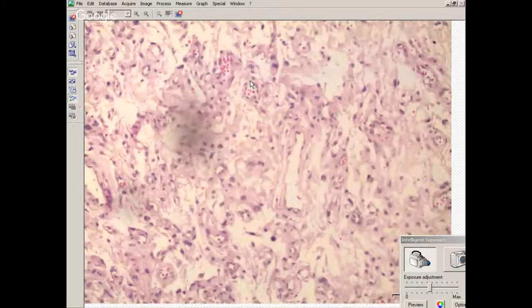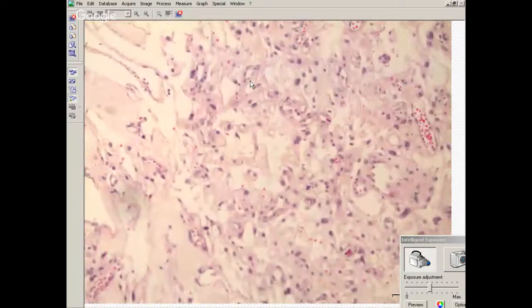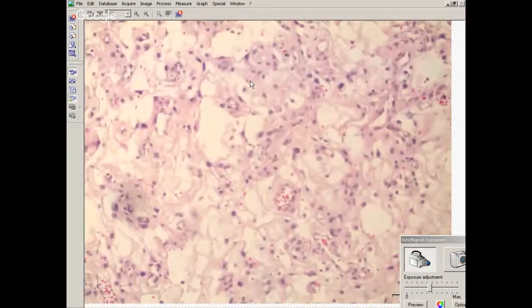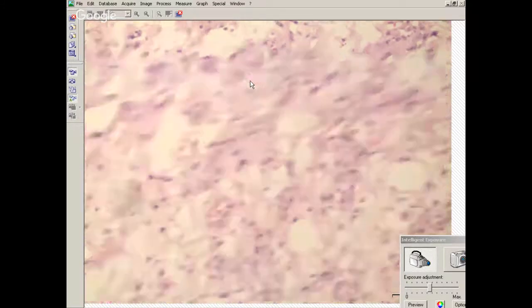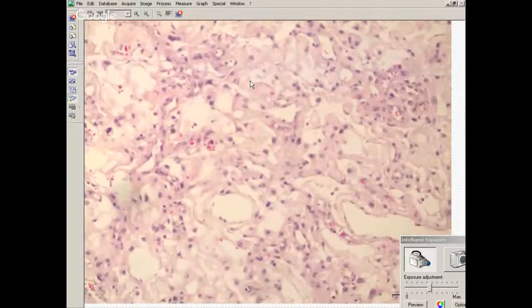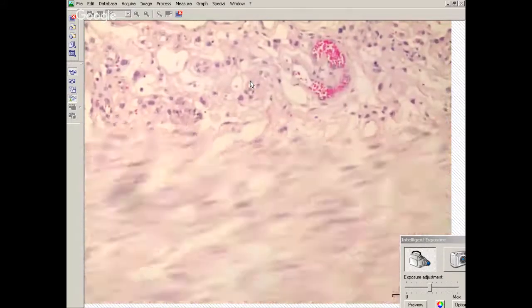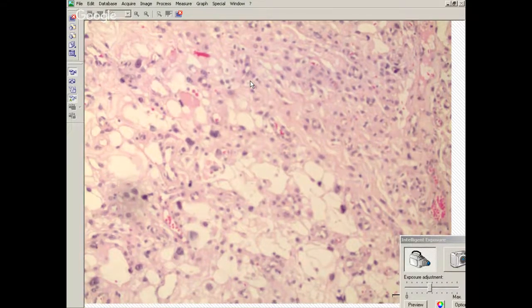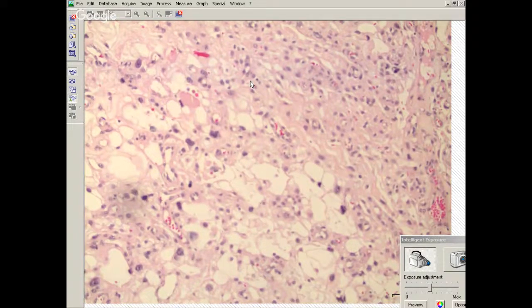This does not have the typical whorls that you would expect to see. This is a meningioma. So what would it stain? EMA. Here's a pseudonuclear inclusion. Meningiomas don't necessarily always look like meningiomas, and they can have some pleomorphism. Now, if they look like a frank malignancy, with really bizarre looking cells, then you have to worry about it being a grade 3. But this has no mitotic figures. You do a proliferation index, and it's 1%, 2%, and it has a few scattered atypical looking cells. Well, these are degenerative atypia in an angiomatous meningioma.